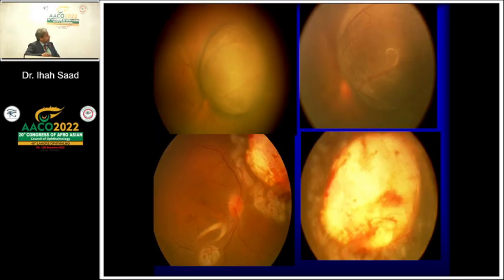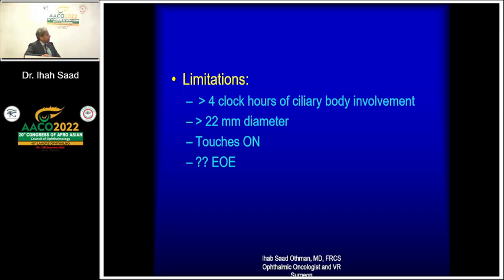Another tumor here, the ultrasound is important to detect that the tumor is not touching the optic nerve, it's away from the optic nerve. We had to go back for a second vitrectomy in 3 months' time to remove the blood and restore the anatomical position of the retina. A very nice scar. A plaque on the sclera, aiming at 3 millimeter thickness, would definitely improve our results on tumor control and recurrence, which exceed 95% in those cases.